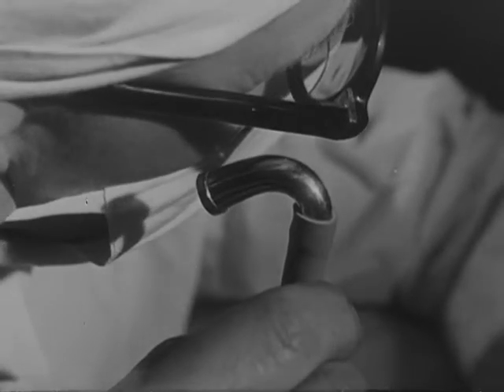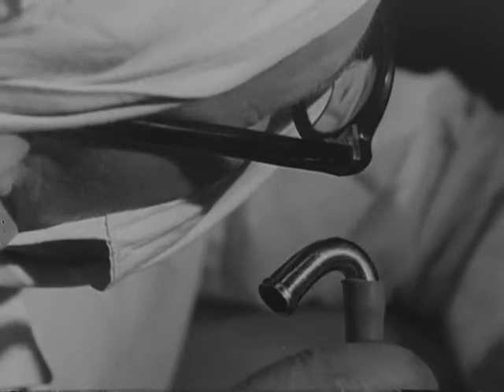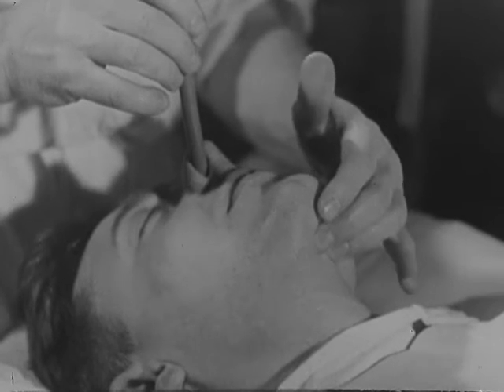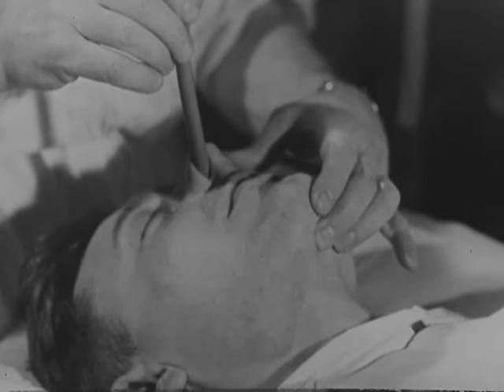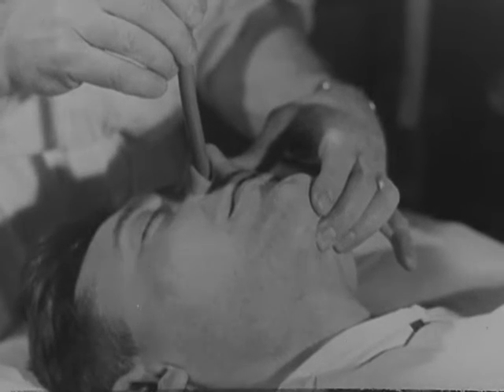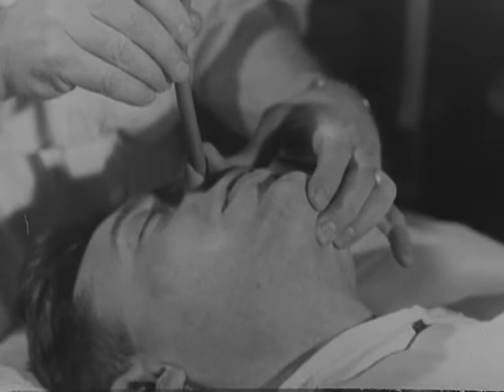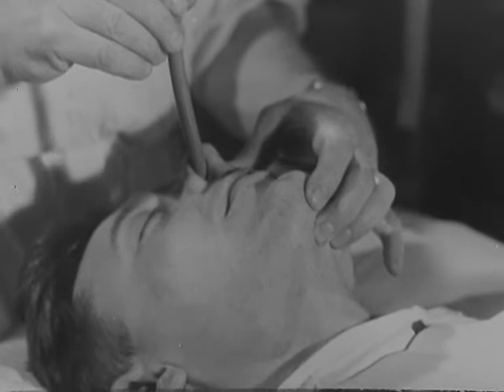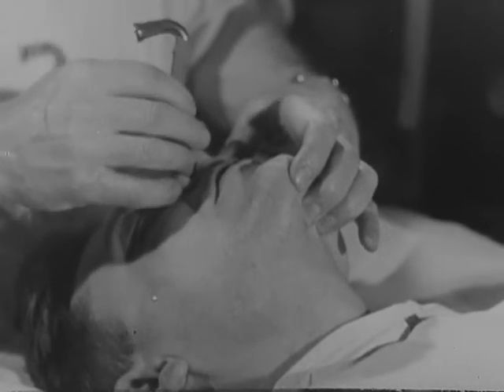As long as the breath sounds increase in intensity, the tube is following the proper course towards the glottis and may be steadily advanced. But if the breath sounds diminish in intensity, the tube is no longer advancing towards the glottic opening. The tube is then withdrawn a little and rotated slightly. During the rotation, the distal end of the tube should pass over the glottic opening. The breath sounds suddenly increase. The rotary movement is arrested and the tube is slipped in.